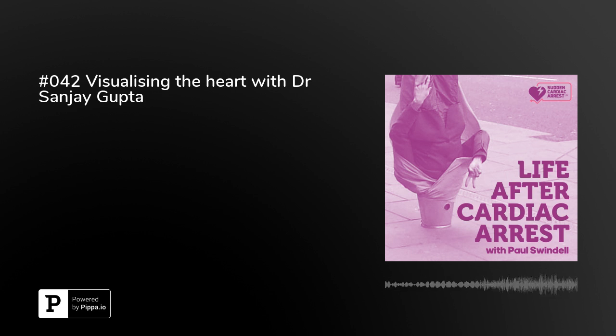So there's a lot to be said. I mean, cardiac CT is incredible to be able to visualize the heart arteries in this way and to have a test which has been shown that if it's normal, it portends to really good patient outcomes is really reassuring.